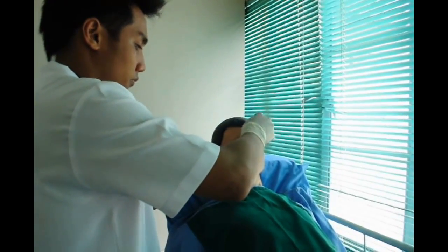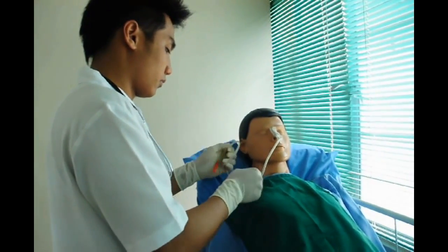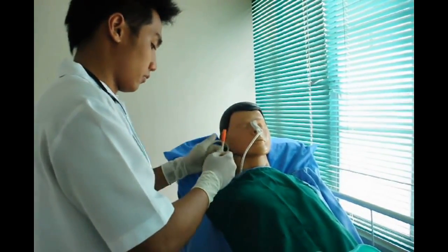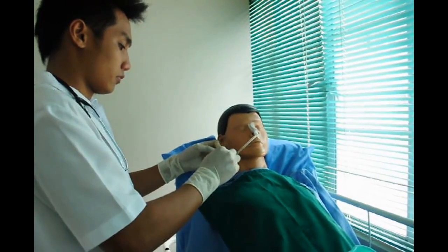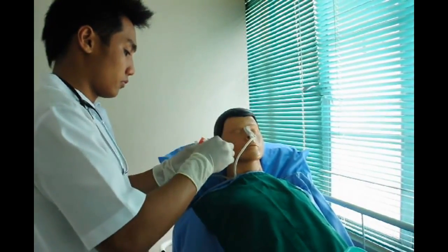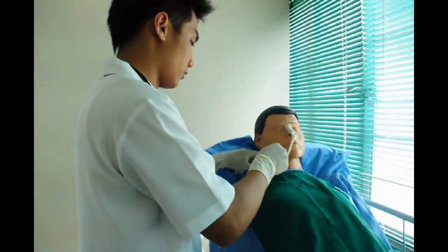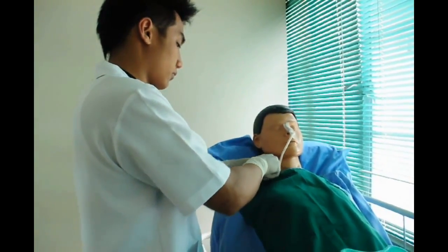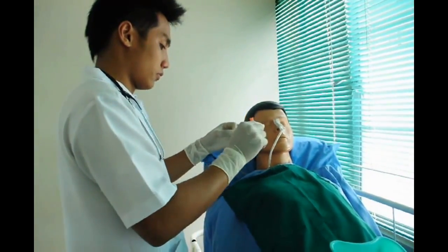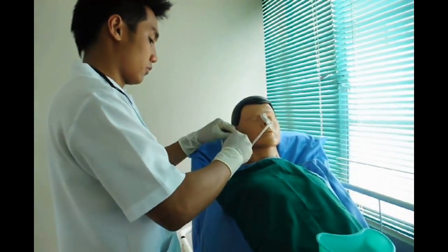Clamp the tube and cap it, or attach the suction according to the physician's order. Suction provides decompression of the stomach and drainage of gastric contents. Secure the tube to the patient's gown using tape. This prevents tension and tugging on the tube. Provide oral hygiene every 2 to 4 hours. Oral hygiene keeps the mouth clean and moist.